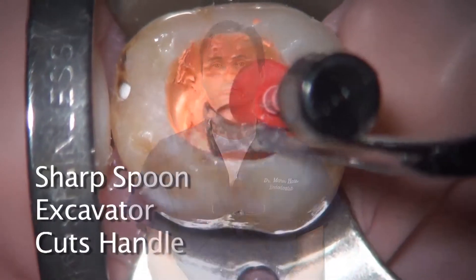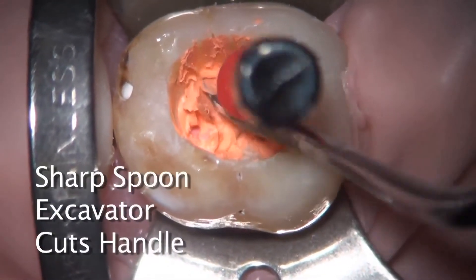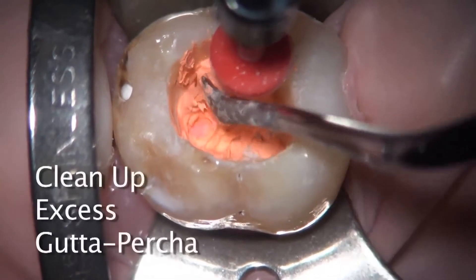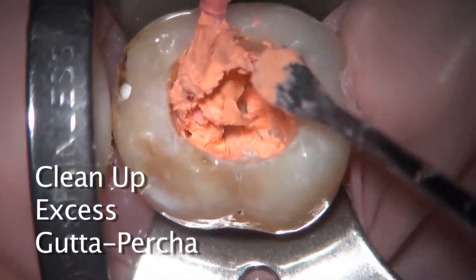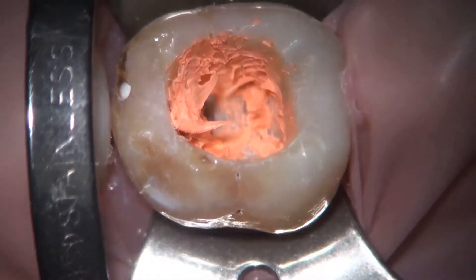To recap, removal of the gutta core carrier and warm gutta percha is very simple and unique to gutta core. You may use any technique you wish, including round burrs, but I found the hard way that I don't like using burrs, especially high-speed burrs, and that a sharp spoon excavator works best.